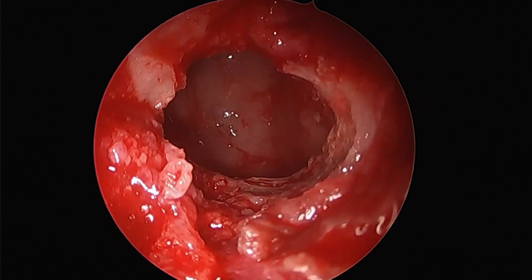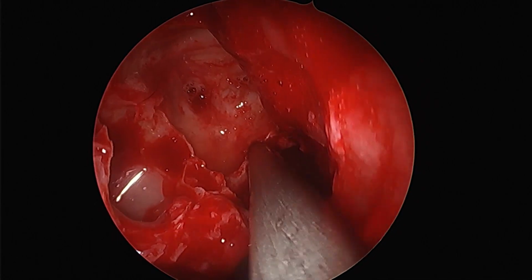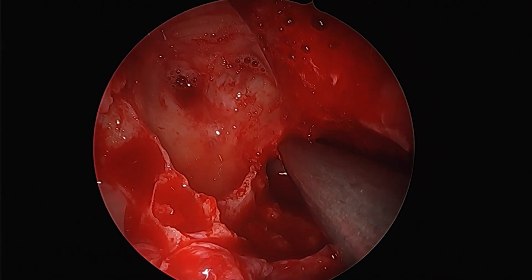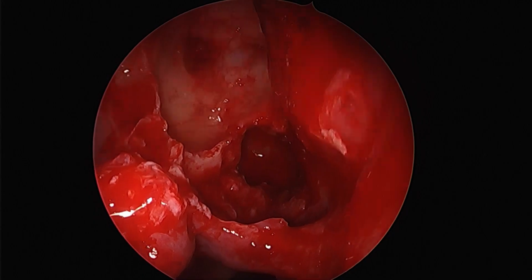And you can see how thick the bone of the anterior face of sphenoid is, and why it was not letting us get an entry inside it. We are going slightly again superolaterally to increase the opening and trying to merge this with the ethmoid to be able to see inside better and more conclusively.